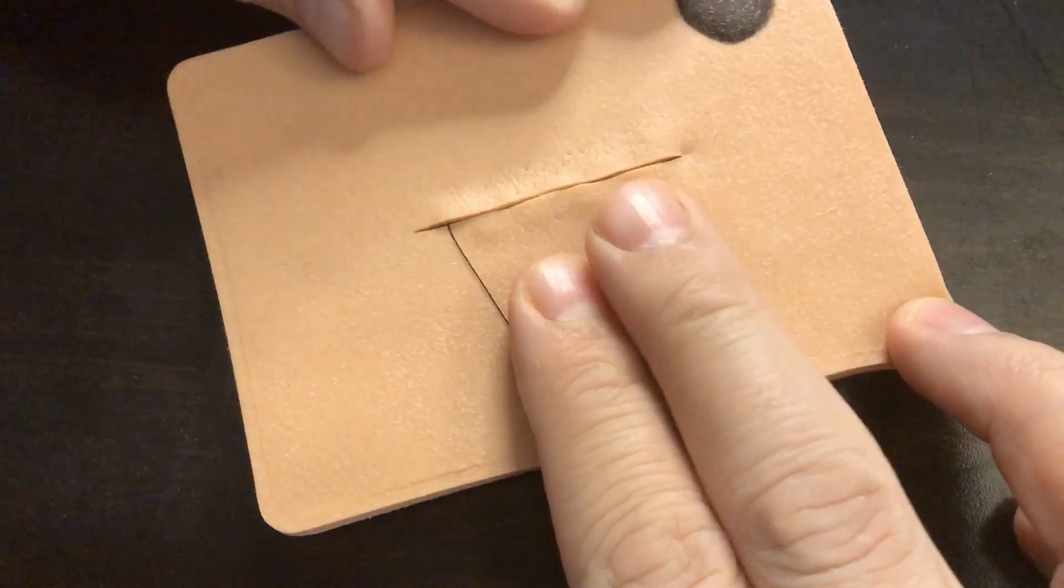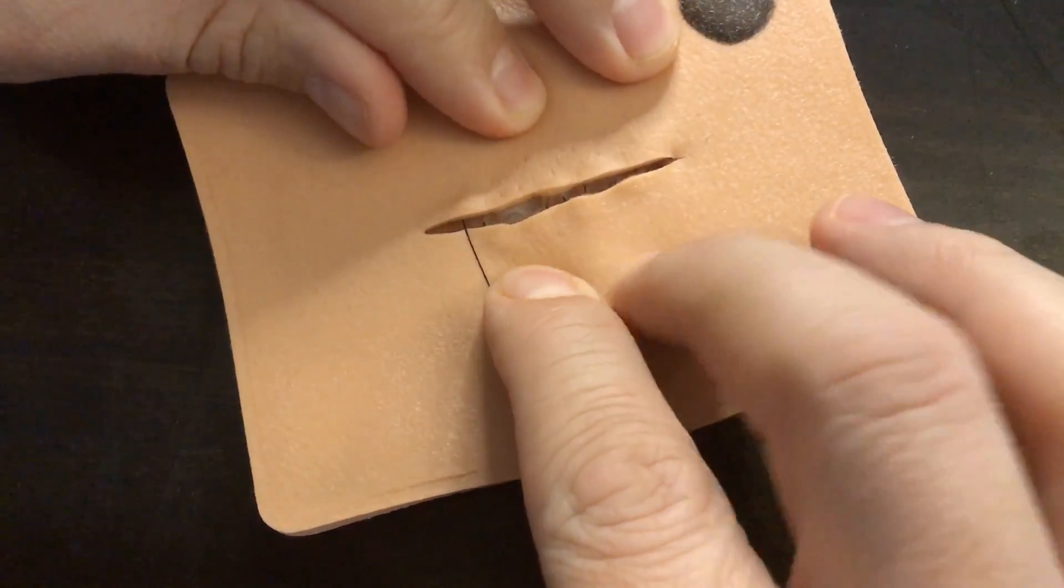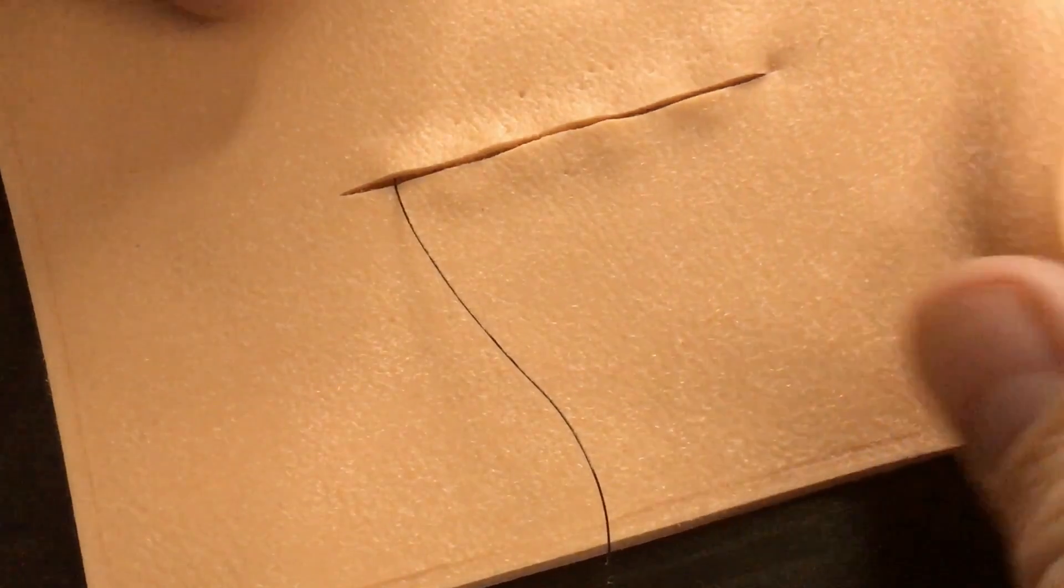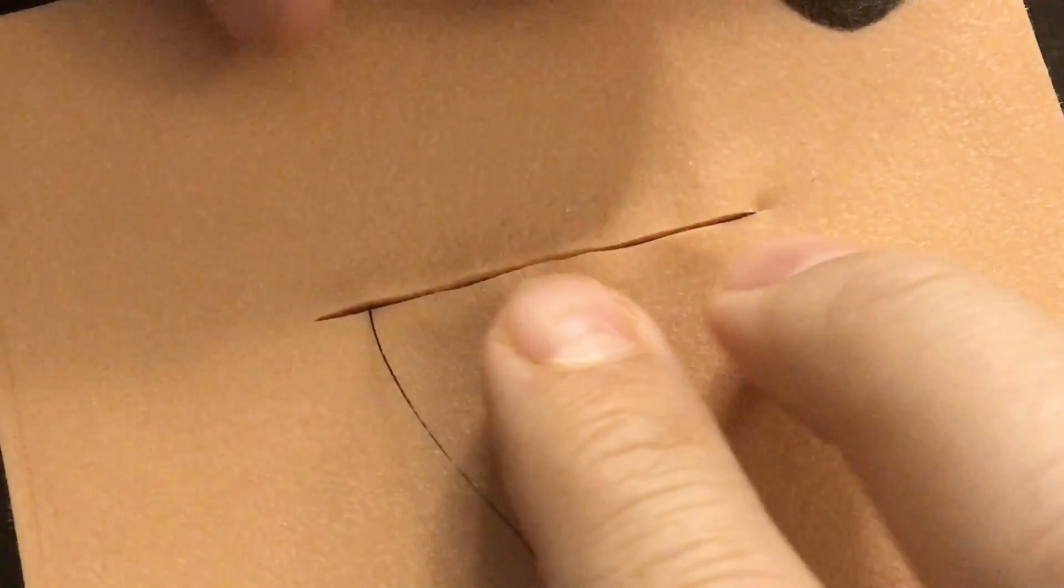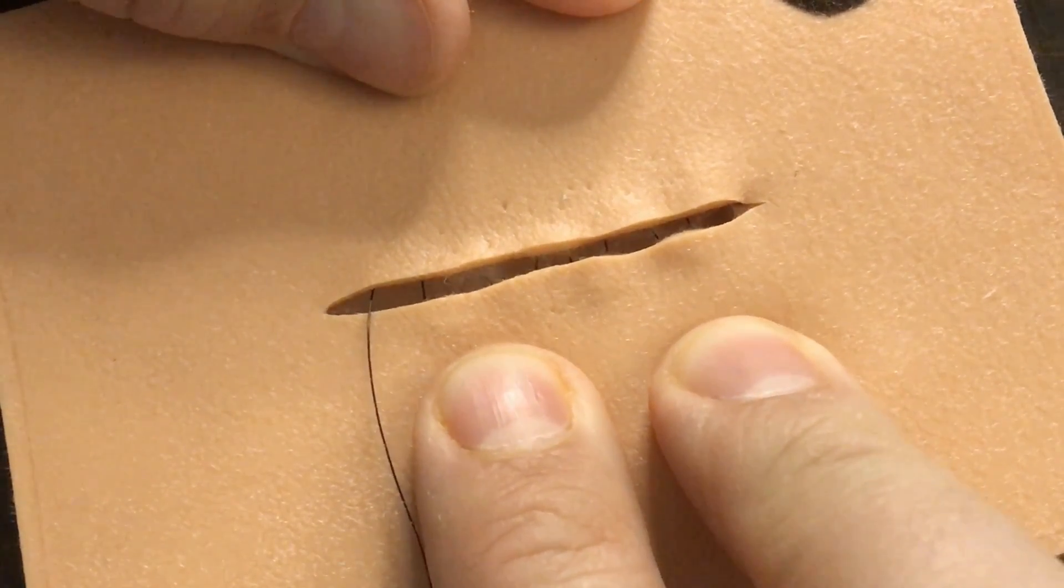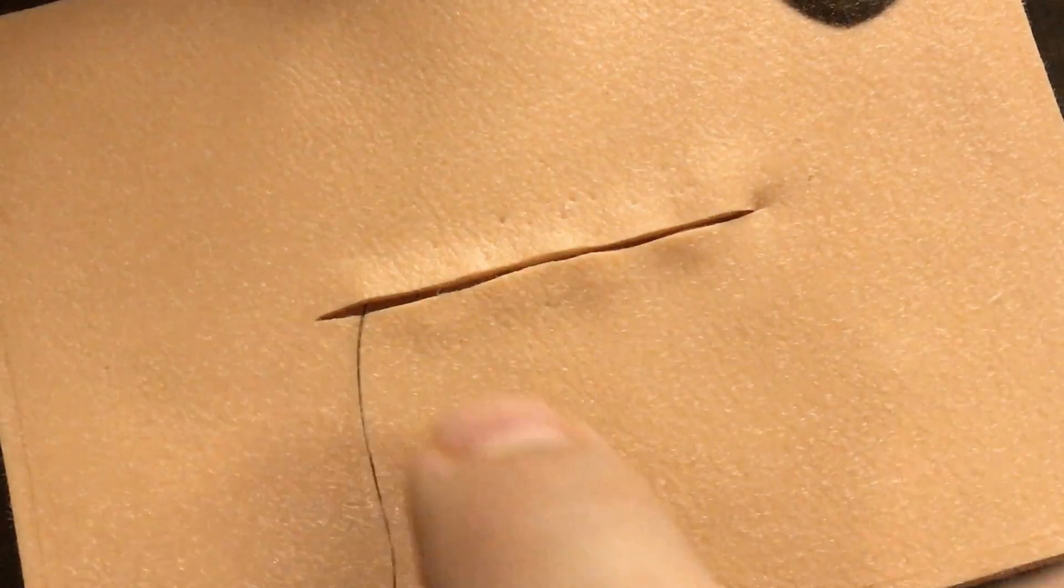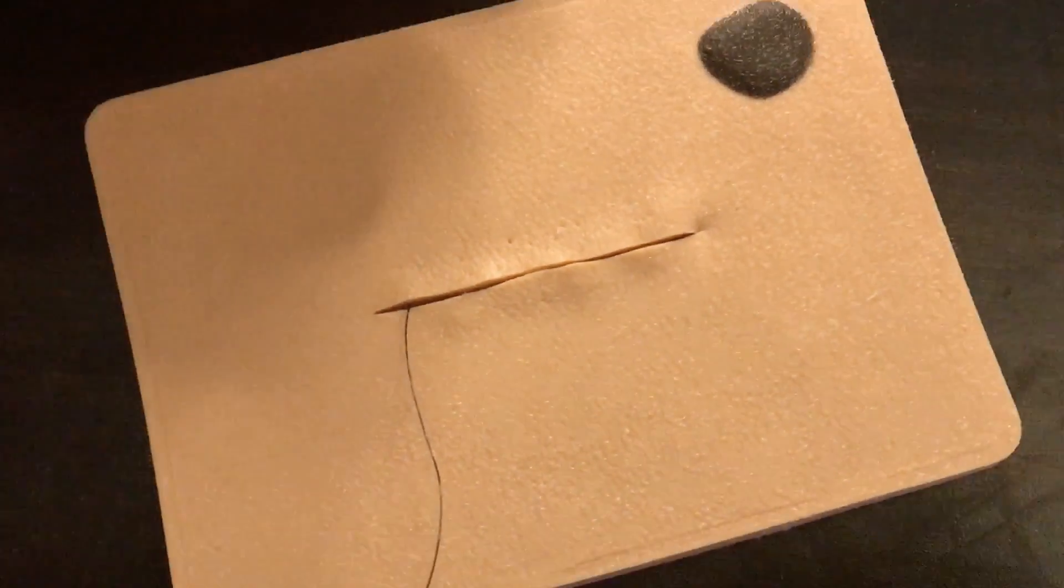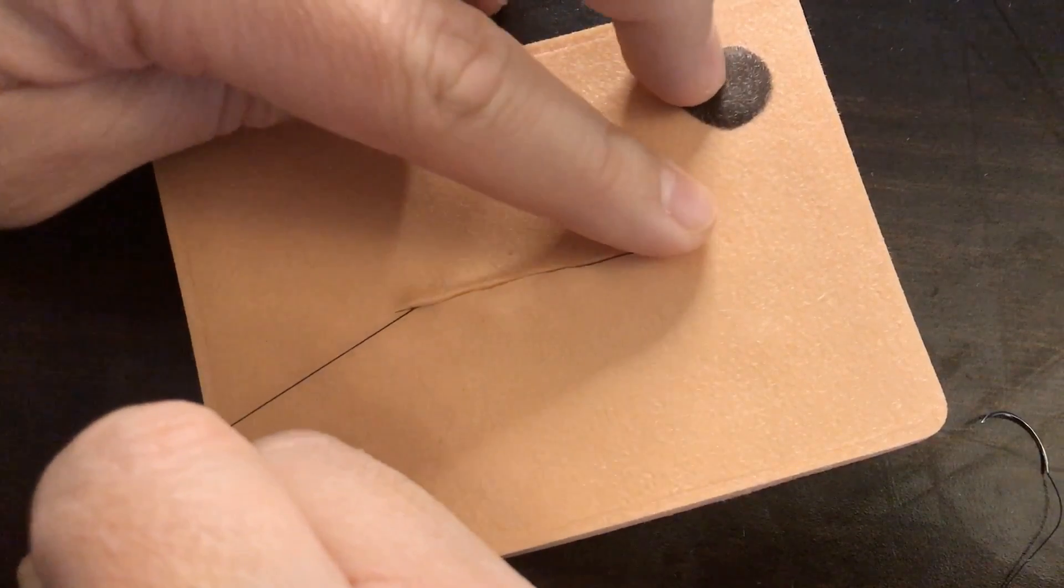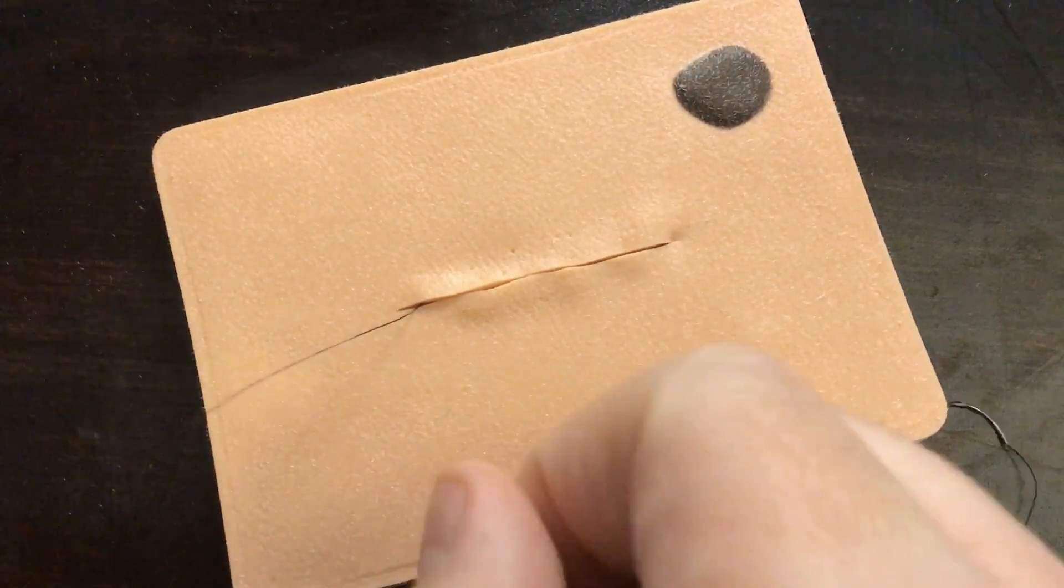Now I'm going to pull this apart just so that you can see the pattern here. If you can look, hopefully you can see it. Maybe I'll zoom in just a touch here, move this into the field of view a little better. You can see the suture goes back and forth in an S shaped pattern, back and forth and back and forth and back and forth. And we tried to stay perpendicular there.